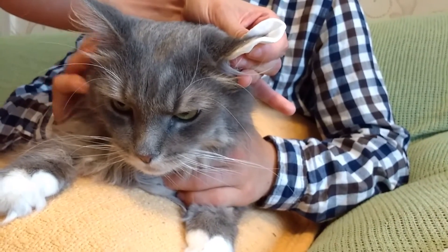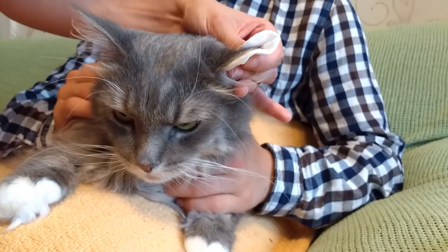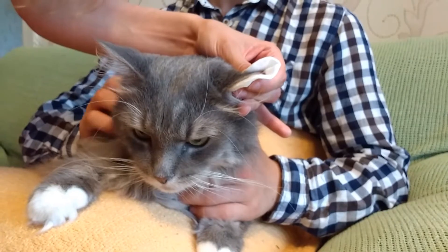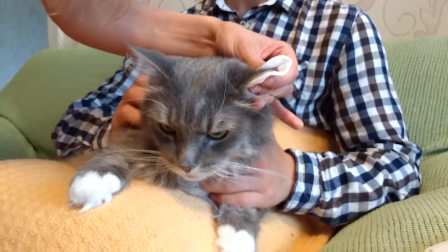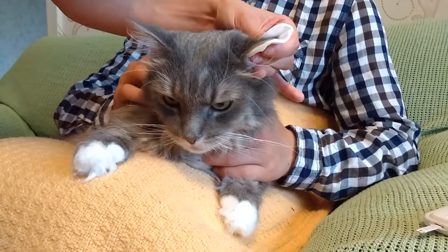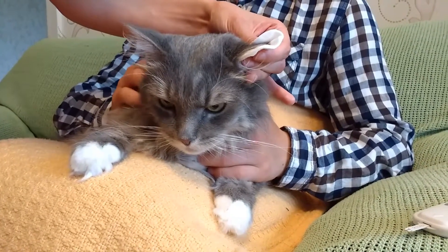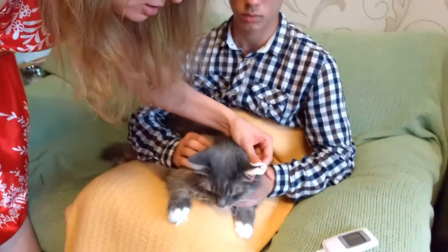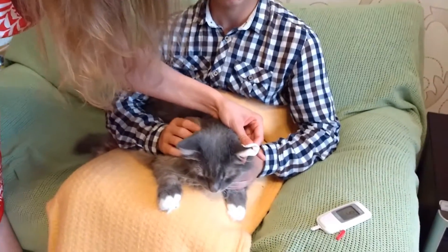And as you can see, the cat is quite calm. It's not gonna be like this in the beginning — in the beginning, I recommend to do it on the floor. And at the end, you won't have to have someone holding the cat, because you can do it wherever the cat is.